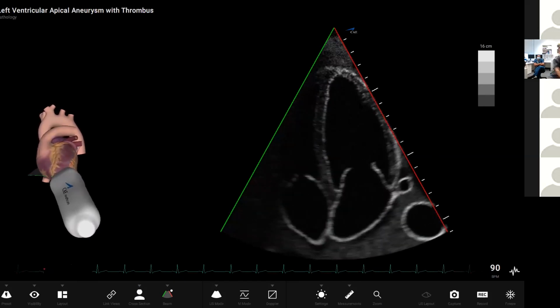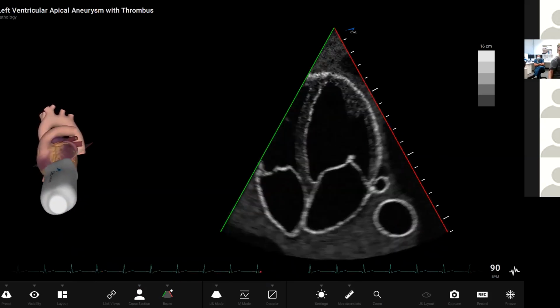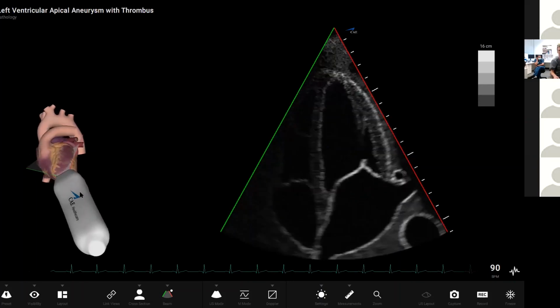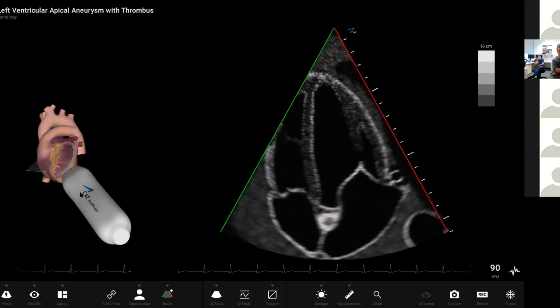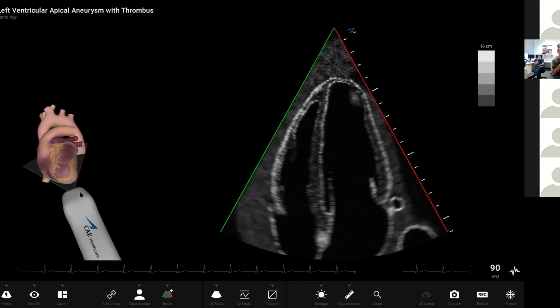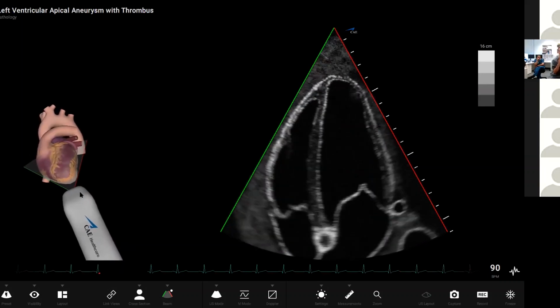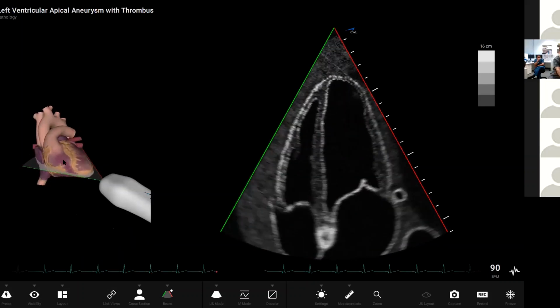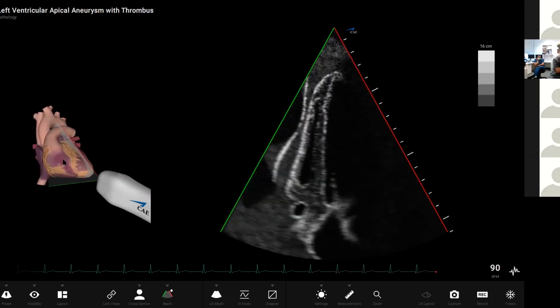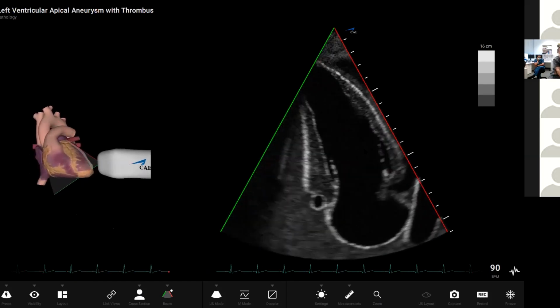Now, if you look on this pathology, if I take my standard apical view, I cannot see a clot in there. Let me just check I've got the right pathology. Yeah. So with my standard apical 4-chamber view, I do not see an apical thrombus. Even if I come down a rib space, I might be able to pick it up, but you can miss pathology if you just stick to your standard view. And that's because you've got a complicated 3-dimensional structure, but a 2-dimensional imaging tool. Even if you go to your 2-chamber, again, you can miss the pathology if you just stay in one plane.